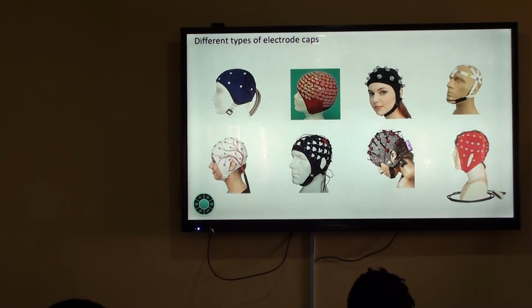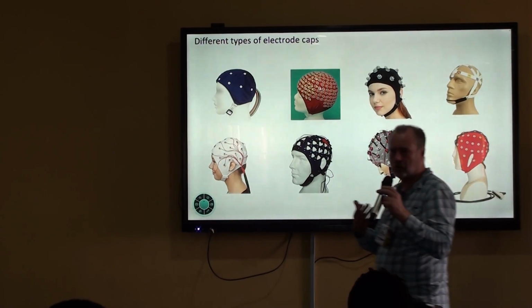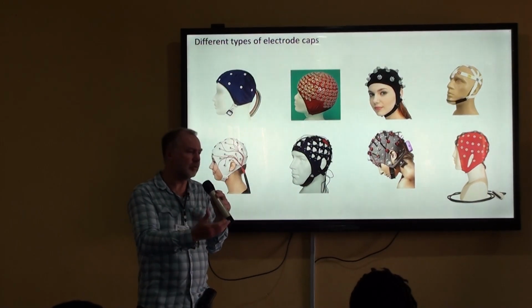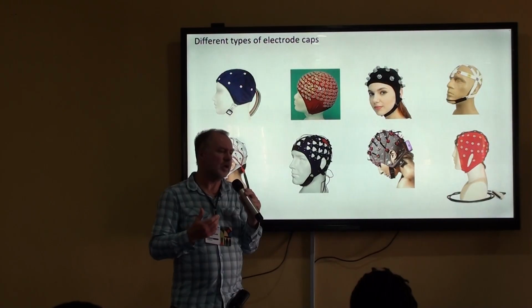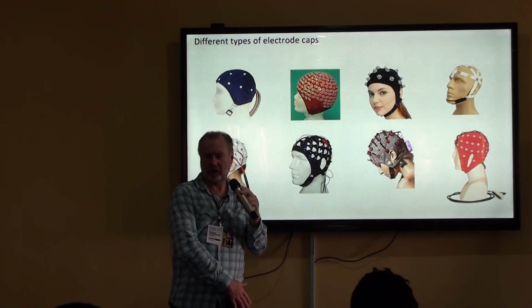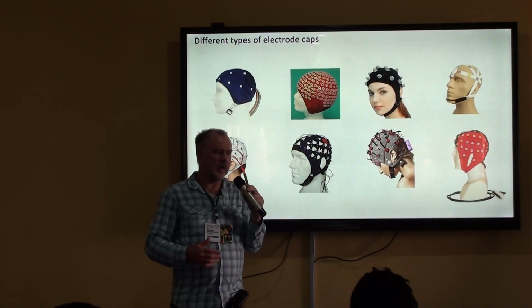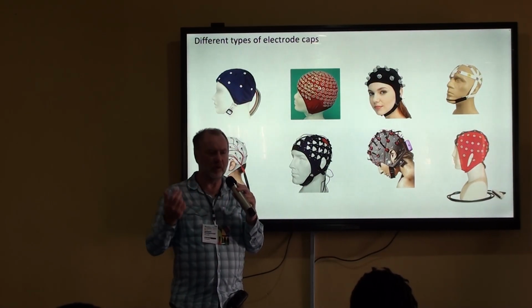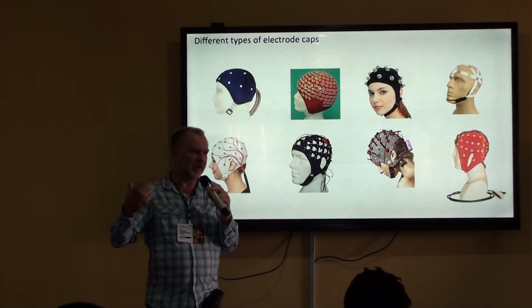So a Holter EEG is for long-term monitoring of the patient, and typically that is used for patients, with a small device, usually something that you would wear on the belt, similar to the microphone that I'm wearing here, so that the patient would walk around and you could record the EEG over a long amount of time, like one or multiple days.